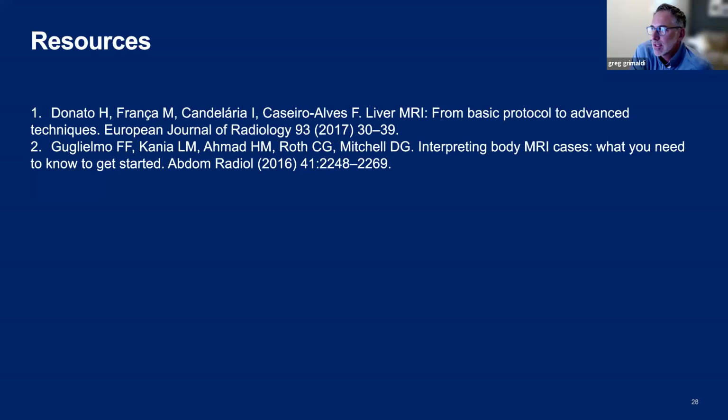Okay, anything else? Yes, this is Heather from UPMC. I had a question. Did I hear you say that you recommend EOVIST for looking for biliary strictures, like in HAI pump patients? Is that better than gadolinium for the MRCP?